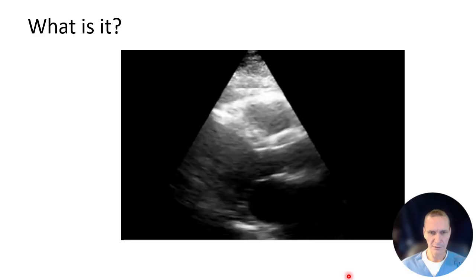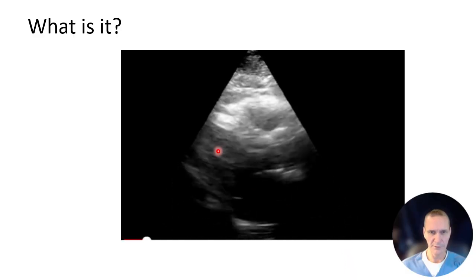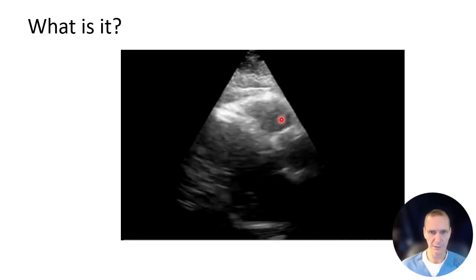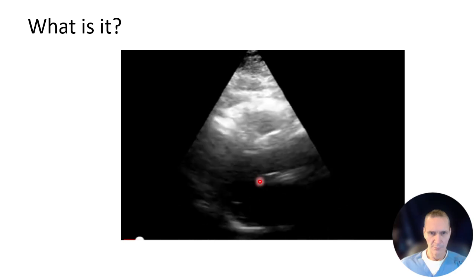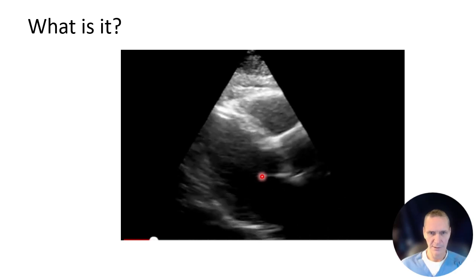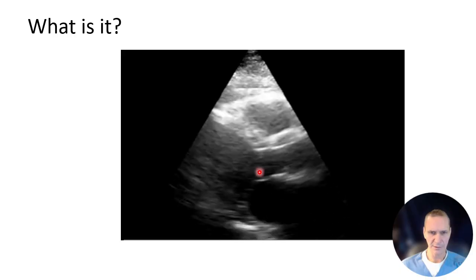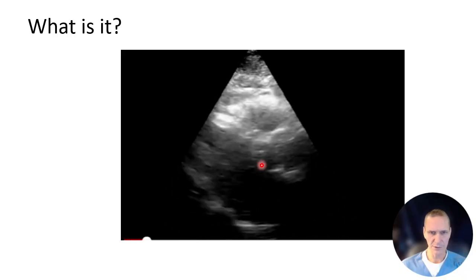This image is a little difficult to see. The LA, the LV, the aortic outflow tract, the right side of the heart. Because I see the anterior leaflet of the mitral valve hitting the septum, that's telling me the EF is probably normalish.